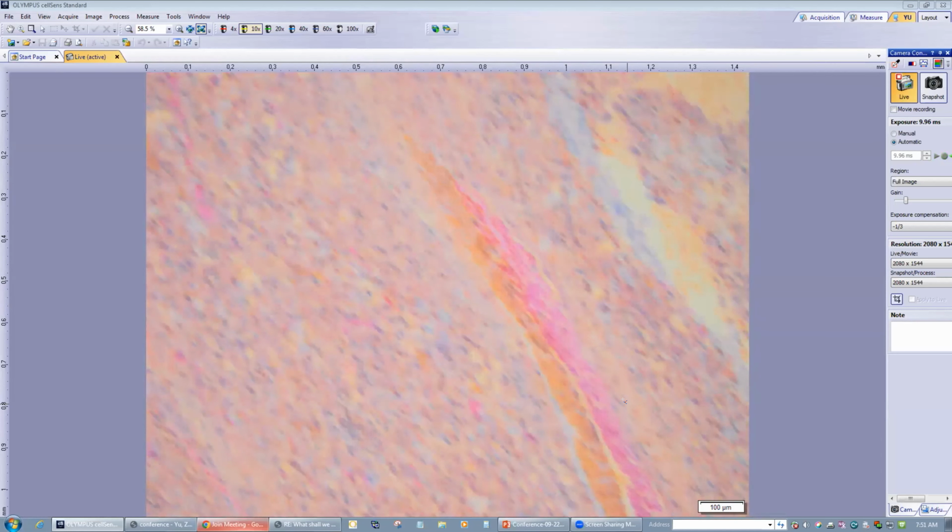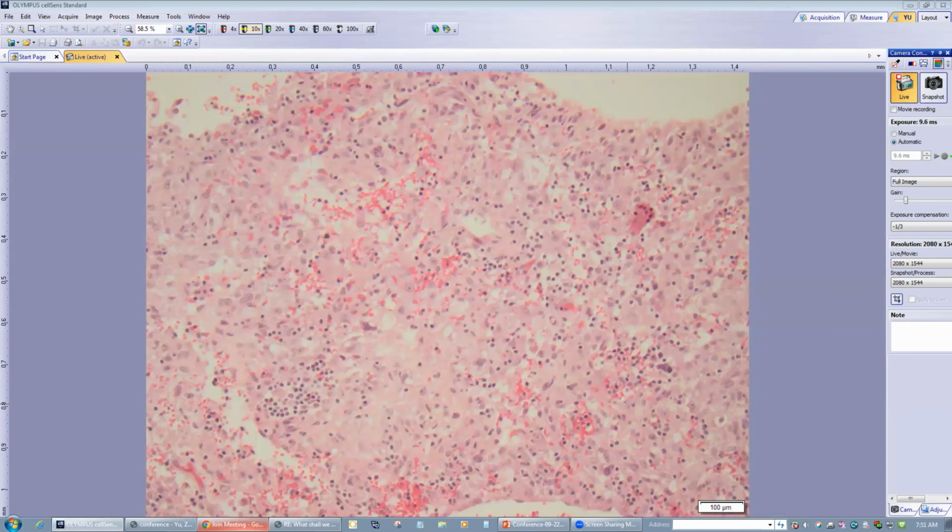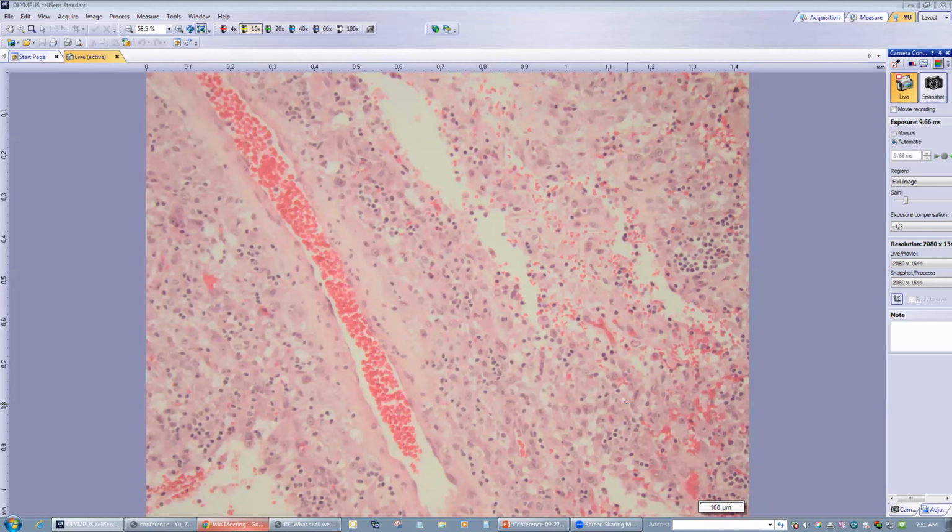We look around, and there are a few other areas like this. So you have an angio component. This one is also not very myo-looking, but this is transformed myo, like smooth muscle transformed cells. Angio, myo, then you have fat, lipoma. This variant is an epithelioid variant. It's very epithelioid cells with cherry red nucleoli.